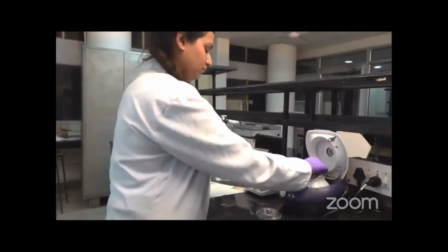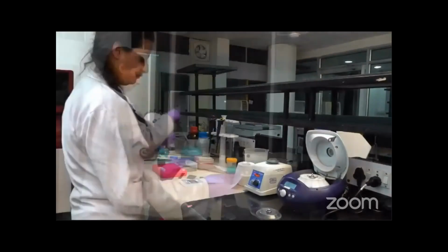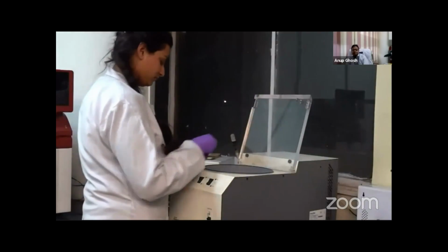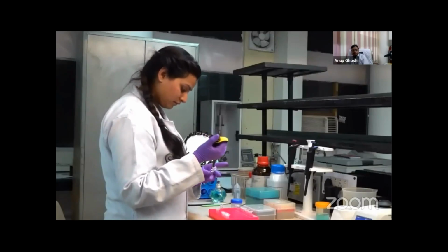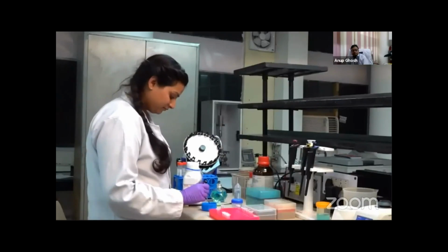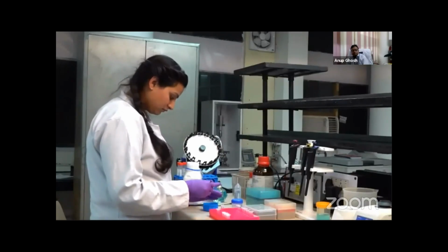The pellet must be completely dried by using a vacuum concentrator before proceeding further. This removes any residual ethanol present inside the tube. Now the pellet is dried and it has to be emulsified with 50 to 80 microliter of formic acid, followed by incubation at room temperature for 5 minutes.